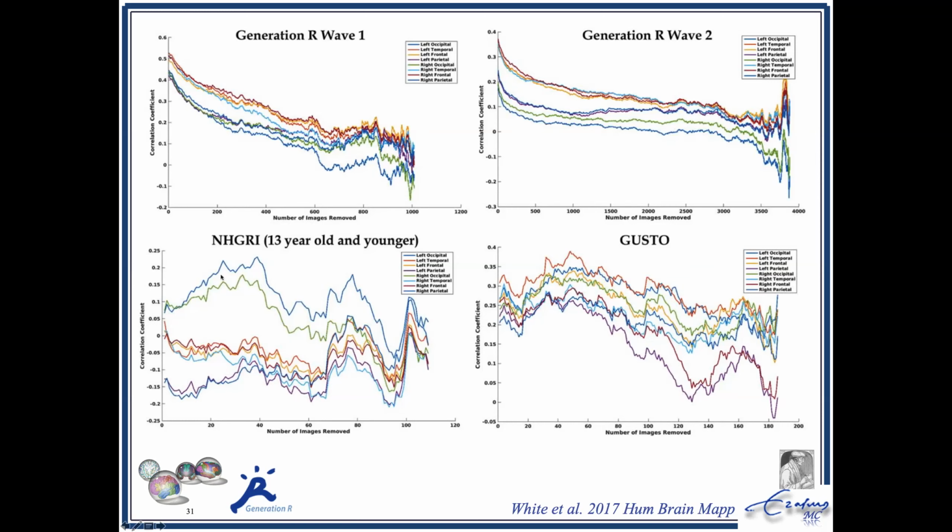Sorry, Ed, to interrupt. What's the focus on zero correlation coefficient? How does that imply a good working algorithm? Oh, it'd be nice to have at some point no correlation between the auto QA measure, which is outside the head, so it's the gradient from the edge of the skin to the air, and a cortical thickness measure inside the brain.